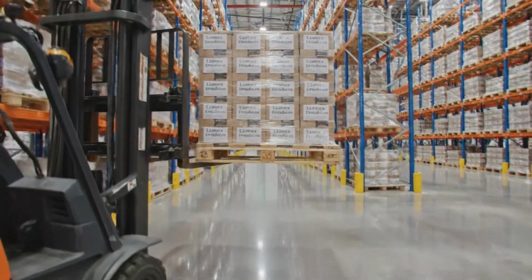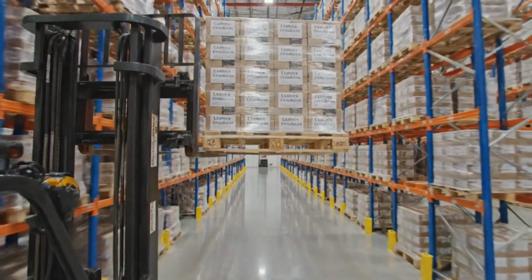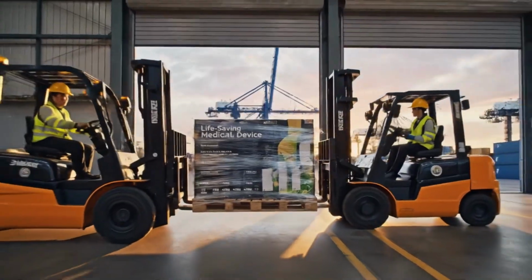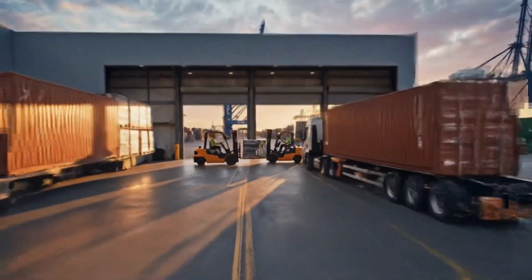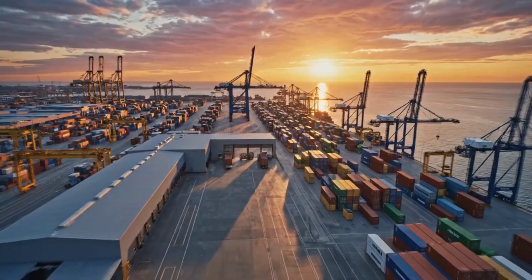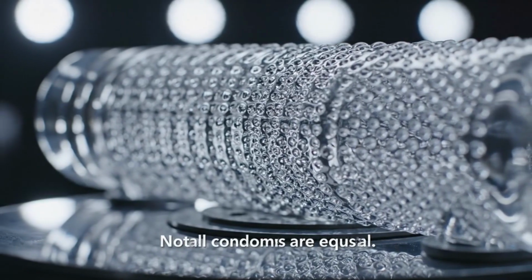Even in storage, we maintain a strict climate to ensure the latex remains in peak condition. Phase 5 is complete. From the sap of a tree to a life-saving medical device, the journey of the condom is ready for the world. Not all condoms are equal.